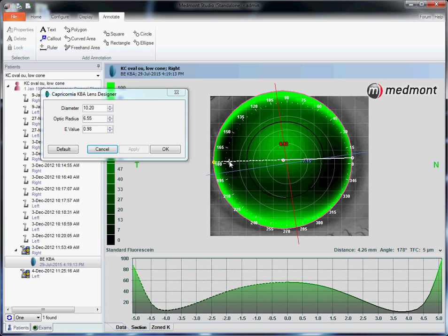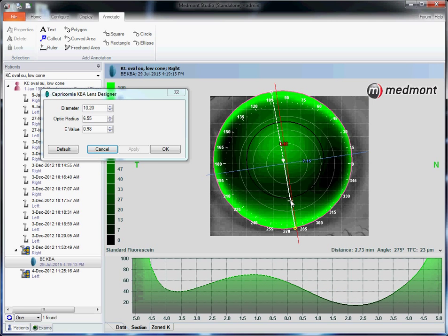We've got a landing at 3 and 9 o'clock that would create good lateral stability. We clear the corneal apex by about 55 microns. We might expect a little wishy-washy visual acuity since we have so much fluid. We've got 70 microns heading north over the cone, 15 microns heading south, 88 microns. We're staying just below that threshold of 90 microns where bubbles can form.